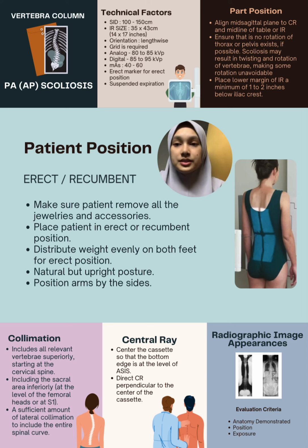The head of the patient should be in a neutral position, facing forward without tilting to any side. Weight is also evenly distributed on both feet for balance. Patient posture needs to be natural but upright to avoid any slouching or exaggerated extension of the spine. Also, the arms should be put by the sides of the patient.